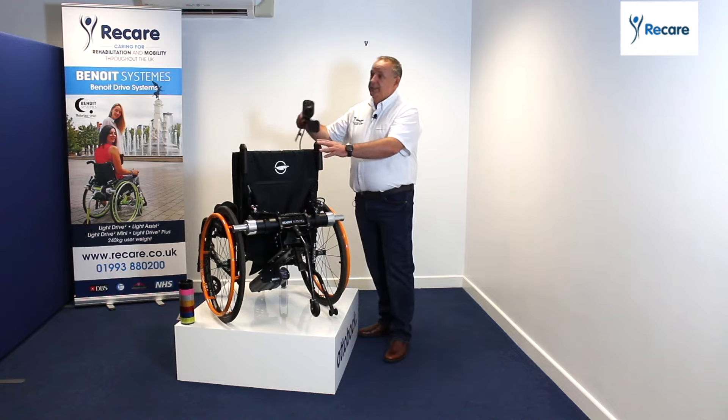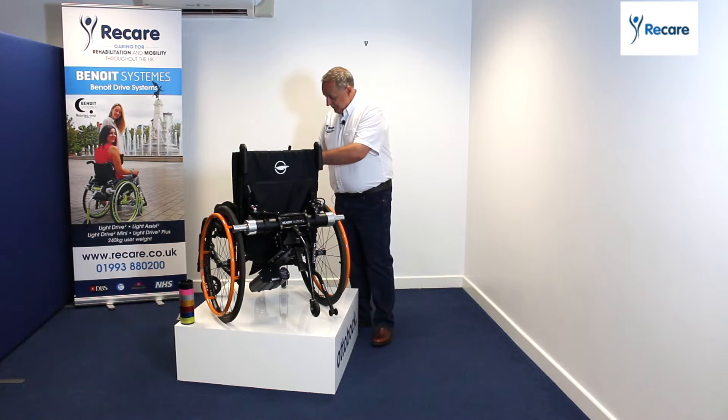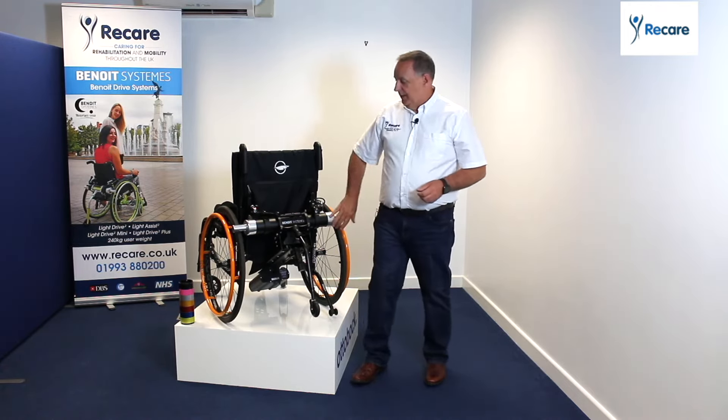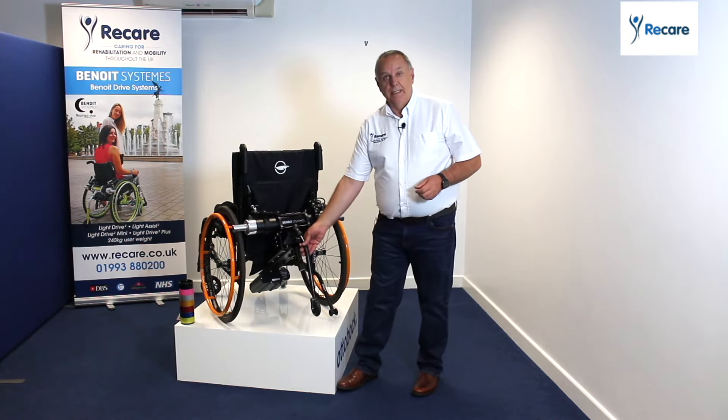You've got a controller, simple to operate, programmable, on the front. You can have it on the rear as well if you wish, or you can have dual control. You've got motors, one on the left, one on the right, nice and powerful. You've got a battery pack system here and you've got an anti-tipper.